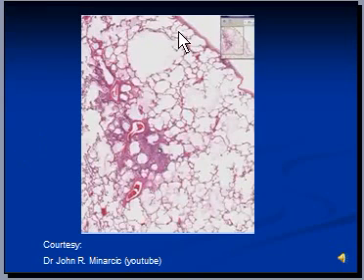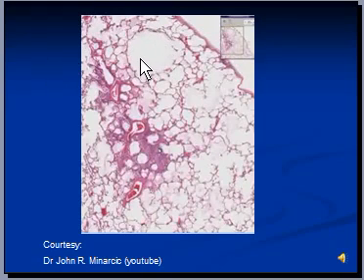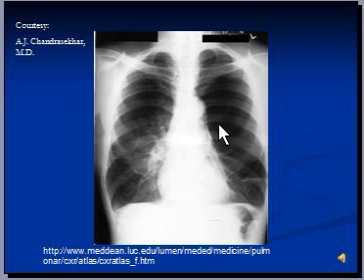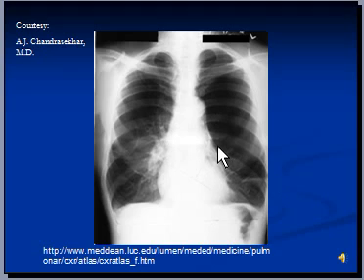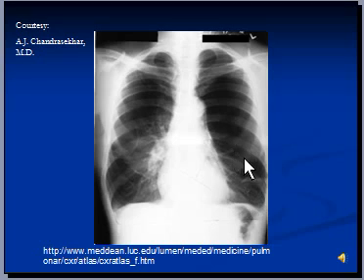Often you can see large pockets of avascular areas known as bullae. This is an avascular area, and if it is large enough it is visible on x-ray as an avascular area that may mimic a pneumothorax. In pneumothorax, air goes into the pleural space and collapses the lung, and you will see the visceral pleura just above the collapsed lung tissue. There is no visceral pleura here — so this is a large bulla.